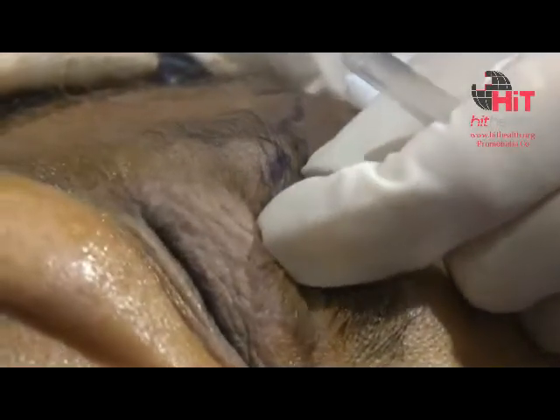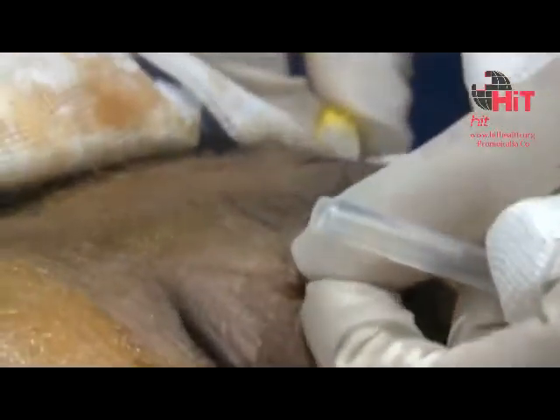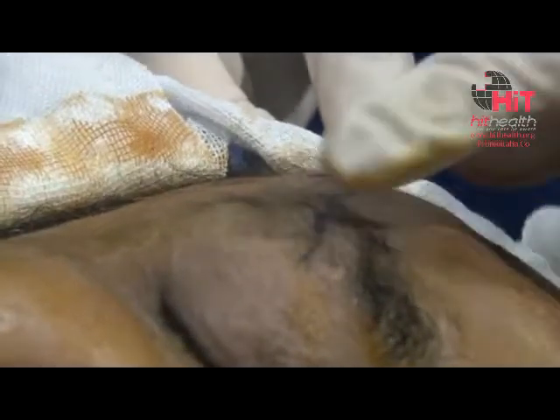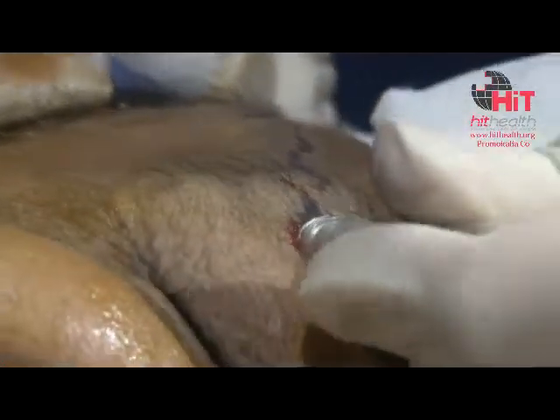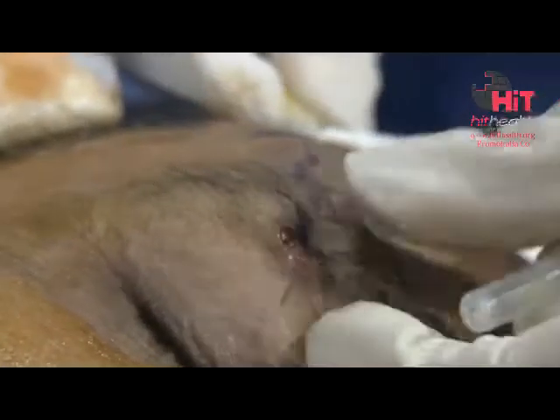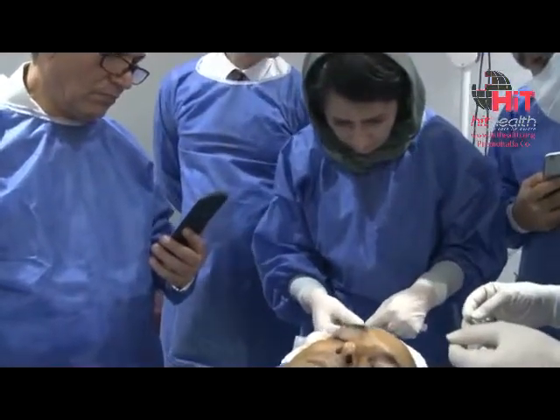When you put together threads, you study symmetry and after you cut — after you make the correct and symmetric result. A little bit more. More eye. Obviously when you stay in the correct way, subperiosteal, it's more difficult to move the cannula because the cannula at the start is blocked. Remove mandrino. Put the threads. It's finished.